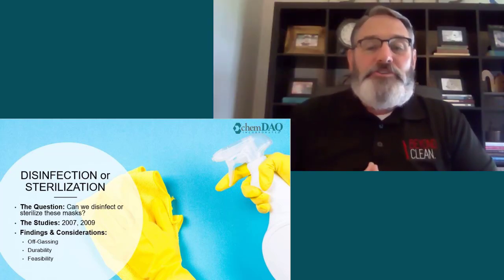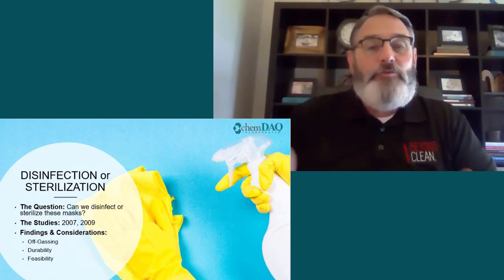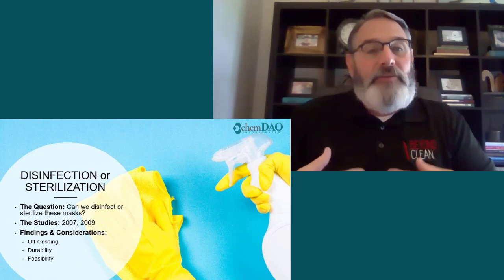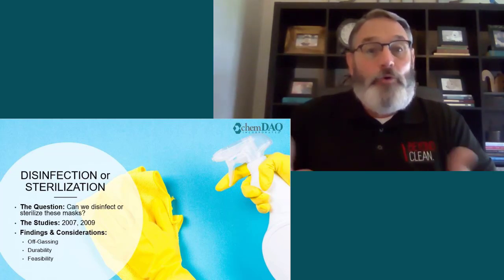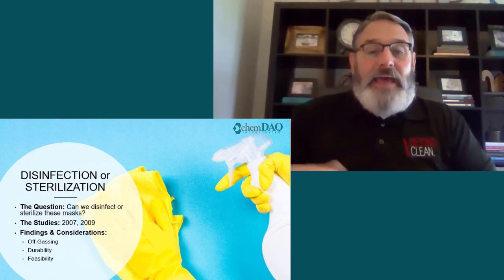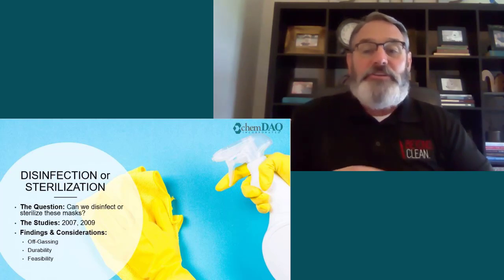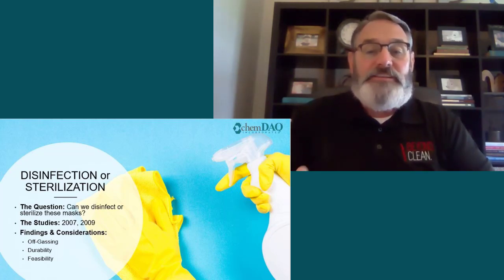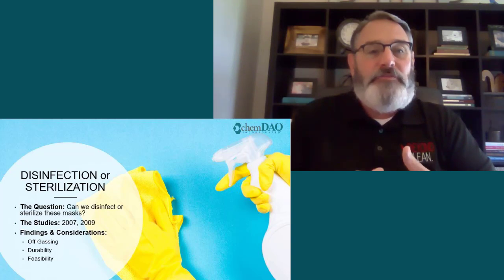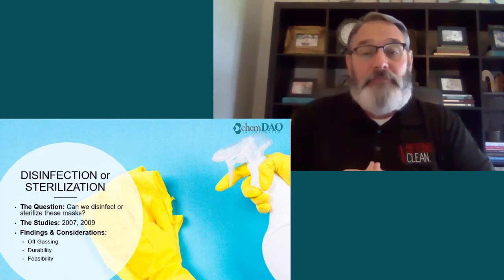That's really interesting, Richard. So how can we clean and or sterilize PPE? We've always been told that if you don't have an IFU that you shouldn't re-sterilize or even sterilize a device. And we've been told that if it's not clean, it can't be sterilized. As studies have become available to healthcare systems, we've discovered that most of this re-sterilization technology or the modalities are unavailable. I'm speaking in terms of UV and ETO. Some facilities have it, but most have gotten rid of it.